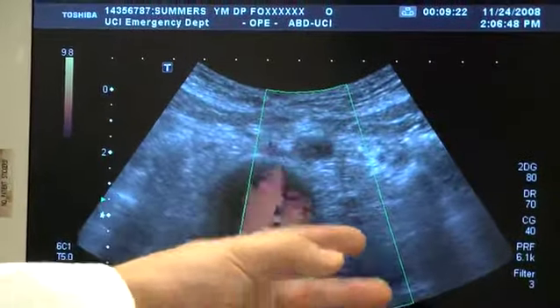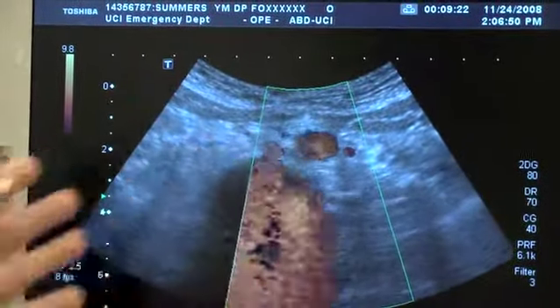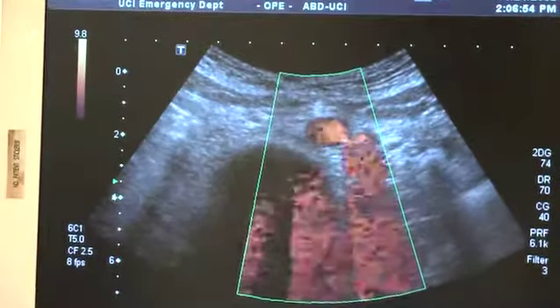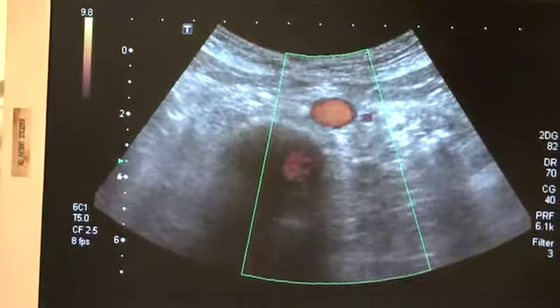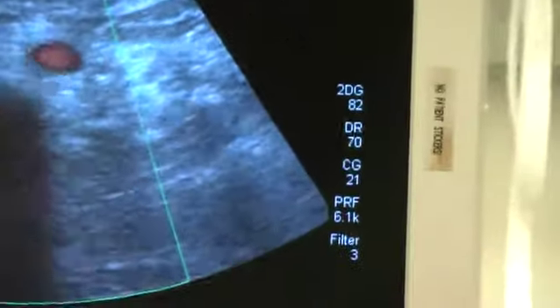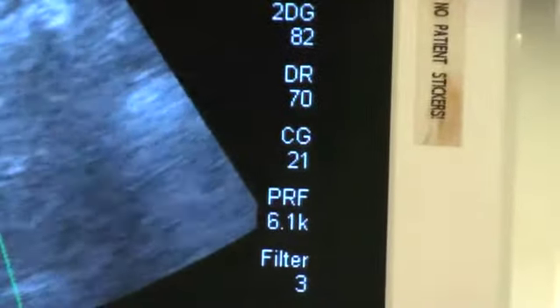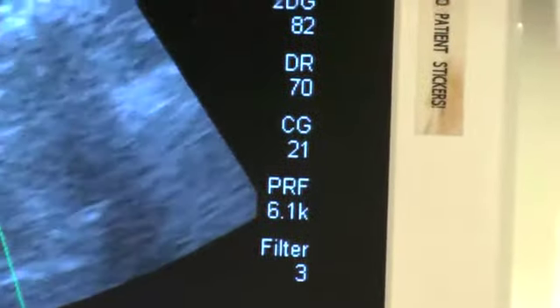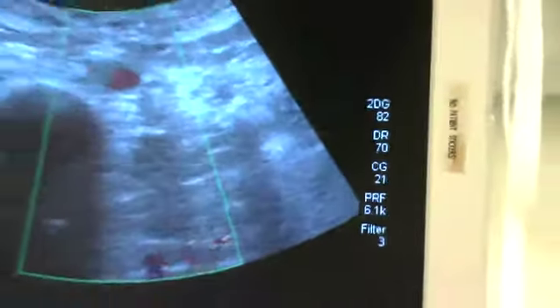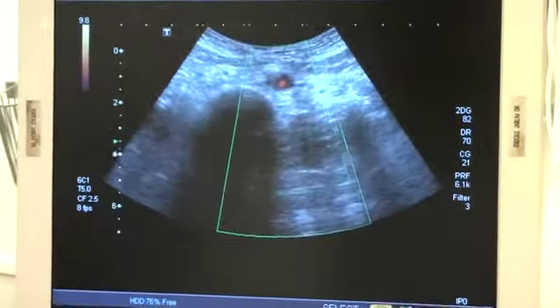I could actually turn that down by turning down the gain. Oh, where's the color gain on this? The color gain is on the actual color Doppler button. Yeah, so you can rotate that to bring less or more. So I turn down the color gain. You can see CG in the right panel there. CG, color gain, is at 21, and 2D gain is at 82. Decreasing its depth maximizes screen real estate.